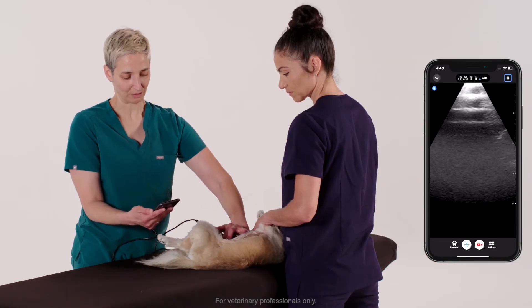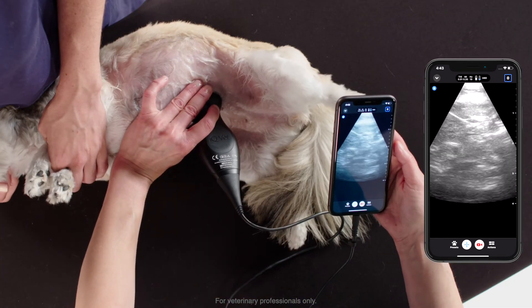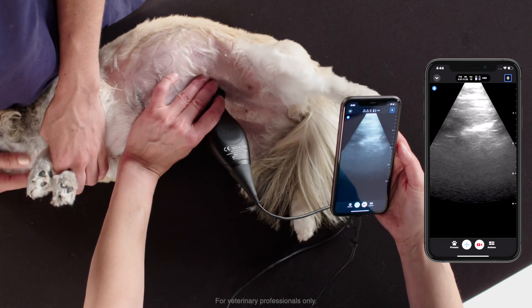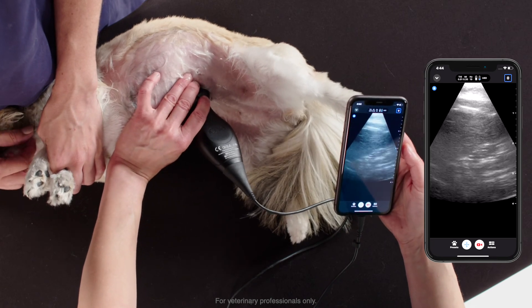The last view for our limited abdominal ultrasound is going to be the umbilical view. I'm just bringing the probe a little bit more towards midline and holding there, I can fan back and forth. Again, looking for any effusion, any signs of ileus. We'll probably catch a little bit of the spleen in there as well, typically.